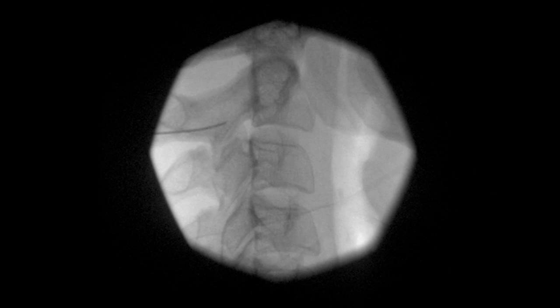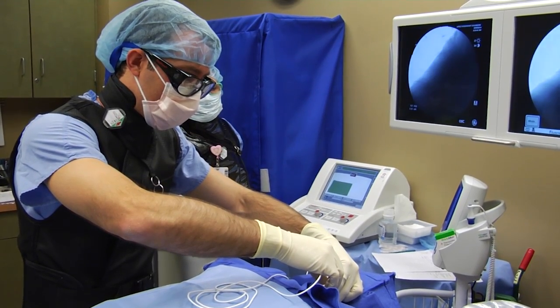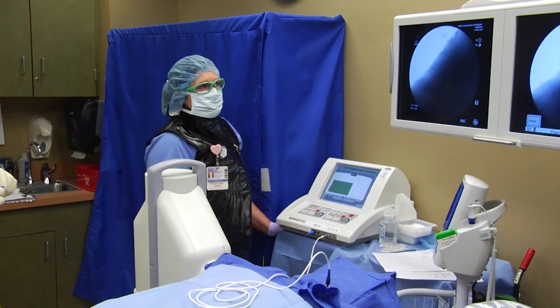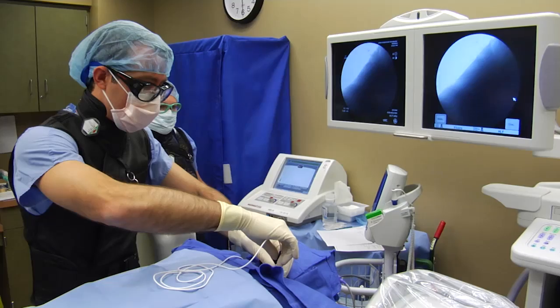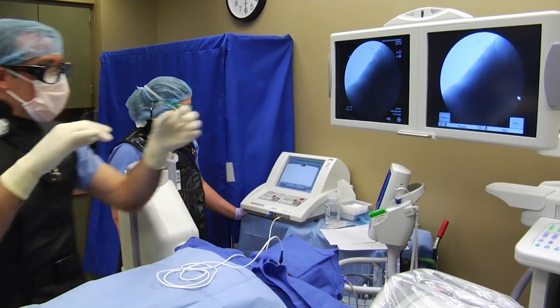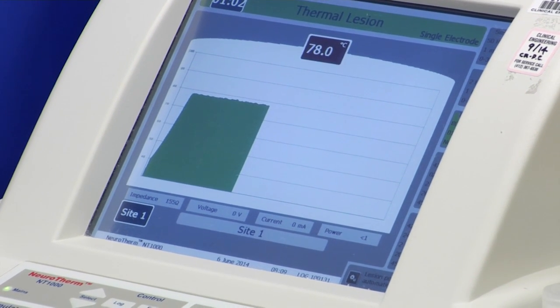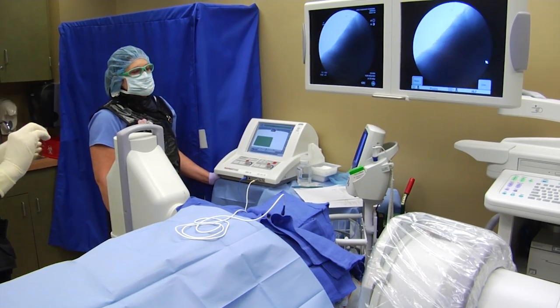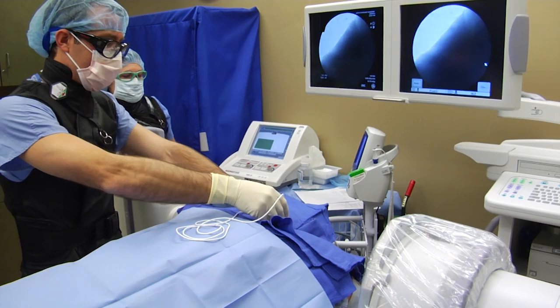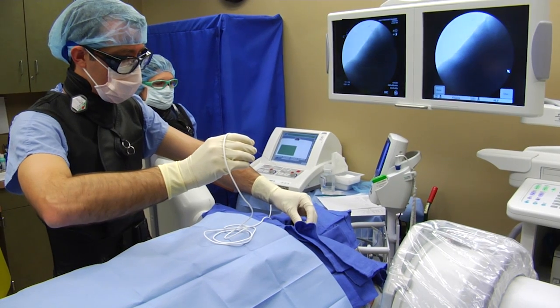Using my initial trajectory and lateral views, I position the needle tip superior to the initial starting position. The needle tip should be positioned at the midpoint of the C2-C3 facet joint line and lie in plane with the C3 superior articular process. After performing the appropriate sensory and motor testing as previously described, I inject my 1 mL solution. Then, I create another thermal lesion using the same temperature and duration — 80 degrees Celsius administered over 90 seconds. Then, I rotate my needle tip approximately 180 degrees, and the same process is repeated.